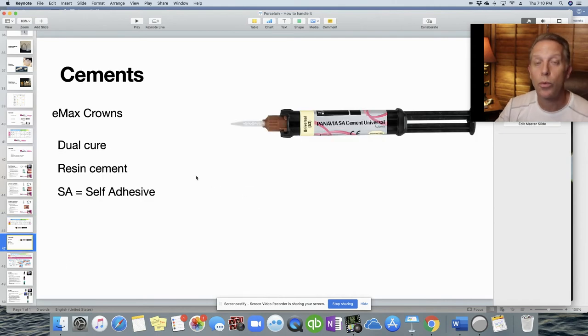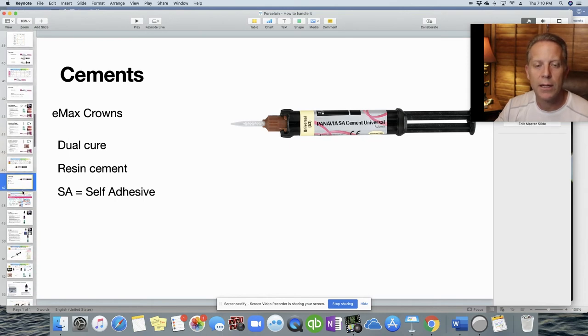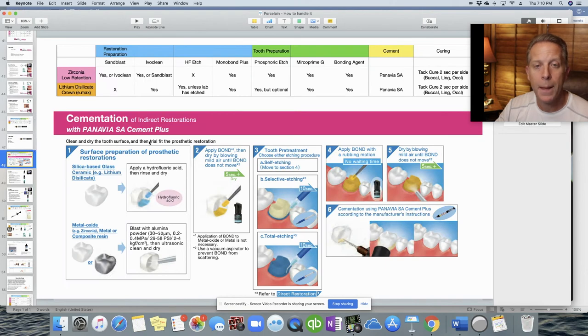Panavia SA is a dual-cure, self-adhesive resin cement — the SA stands for self-adhesive. Per Kuraray Dental's instructions: for silica-based glass ceramics like Emax, clean the inside and apply hydrofluoric acid. For metal-based or zirconia, sandblast. Then paint the internal surface with a bonding agent — we use ClearFil Universal Bond Quick from Kuraray. For the tooth, etch (total etch, selective etch, or skip if using this bonding agent), paint on the bonding agent, dry it, load the cement into the crown, and seat it.